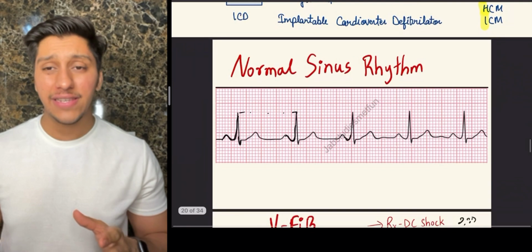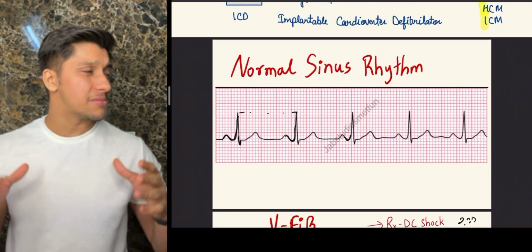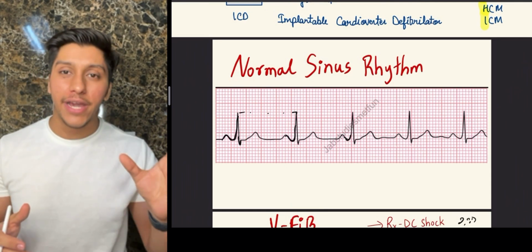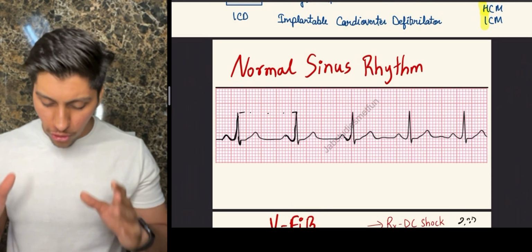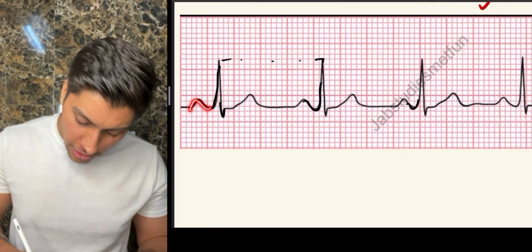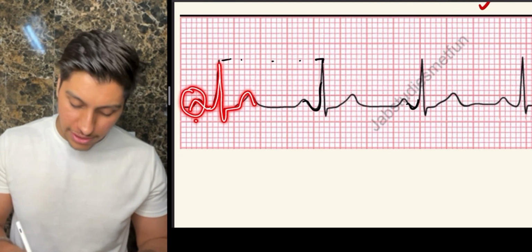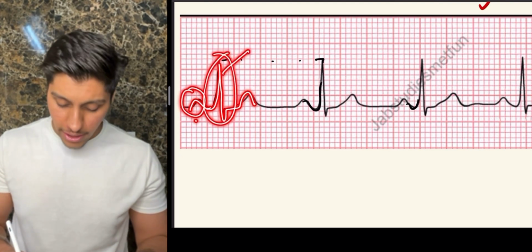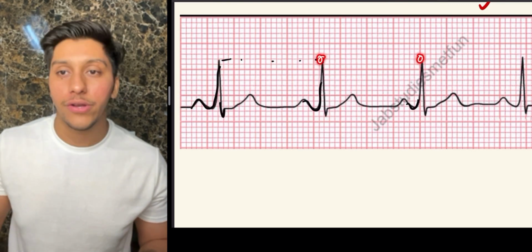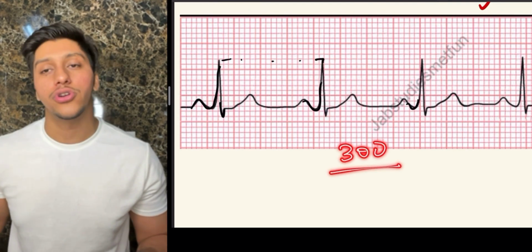Lastly, let us just see some ECG things, so that even though you don't like ECG, you don't want to read some 3 hours, 4 hours huge videos, watch these videos, part 9 and part 10, and you're good to go. Normal sinus rhythm, what you have to see? You have to see the P wave, then your Q wave, R, S and T. P wave is going to be atrial depolarization, QRS is going to be ventricular, T wave is going to be relaxation. How are you going to check the heart rate? Between 2 R intervals. Count the big boxes. Take the big boxes, divide 300 by them, and you're going to get the heart rate.